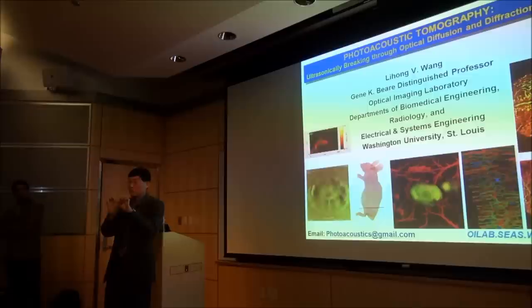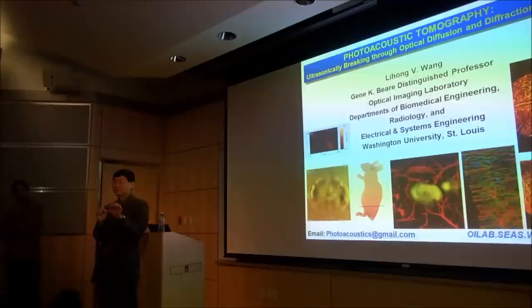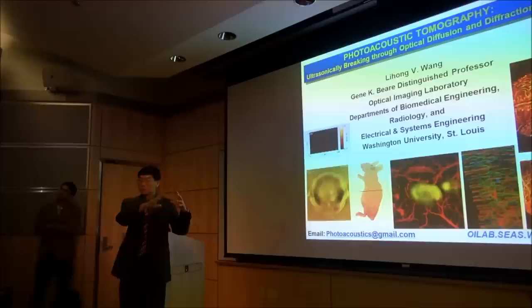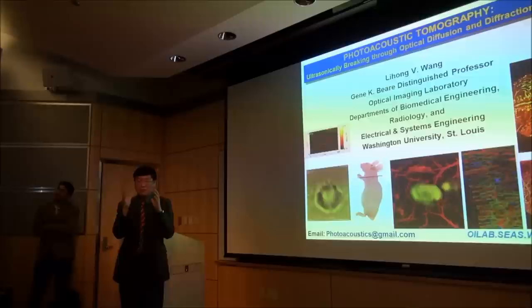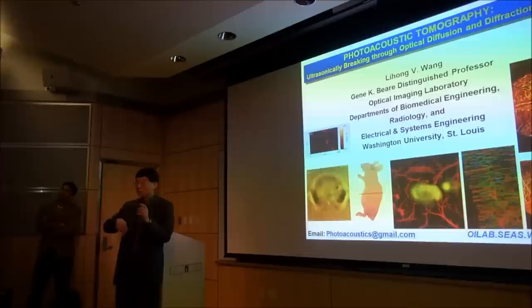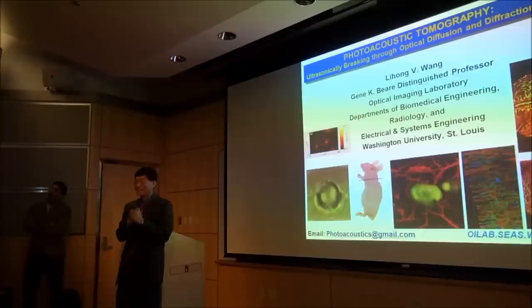When light goes through blood vessels, the scattering is negligible. So you have a known exponential decay inside the blood vessel. And that's manifested in the acoustic spectrum. So by examining the acoustic spectrum, we managed to figure out the decay curve. And that's a relative measurement, very much like a lifetime measurement. That's independent of the concentration. So that decay curve is independent of the local fluence, so that's independent of the light level. And that's one method.